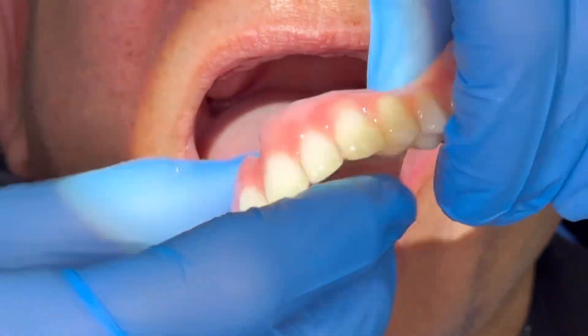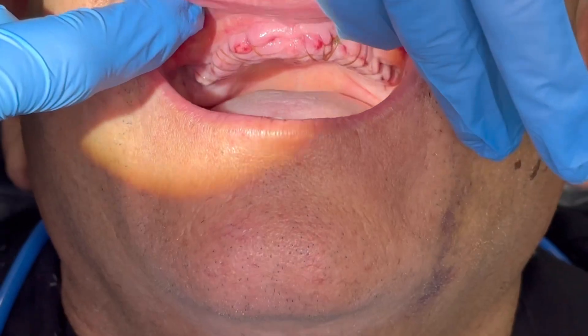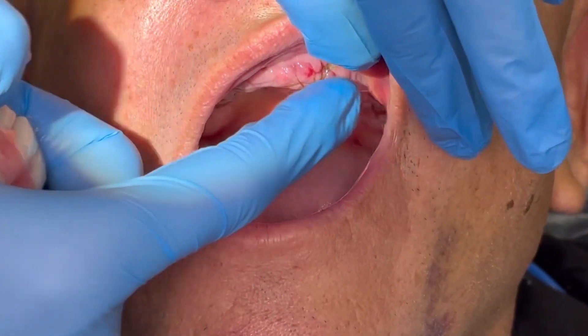This is the patient we saw today. He had an immediate denture placed about a week ago, and you can see that he is healing well.